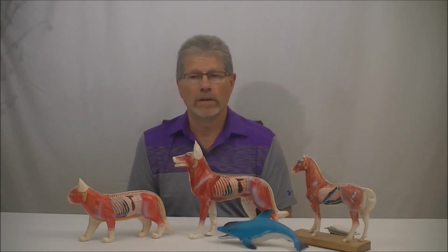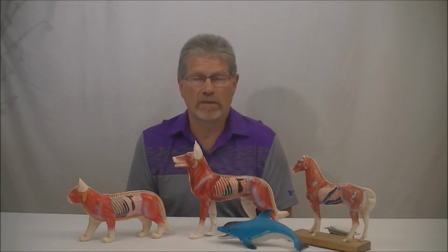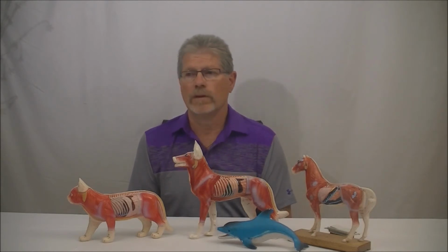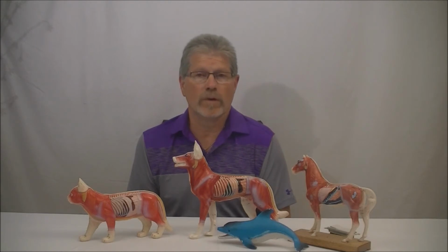But the class 2 with a low level laser can be extremely effective at a lot of those soft tissue problems. Cystitis, cats with inflamed bladders. Oh, what a difference that makes. Chronic renal failure, hepatic issues, intestinal, just inflammatory bowel disease, IBD, other intestinal enteritides can be just made better with proper case management and effective use of the laser.